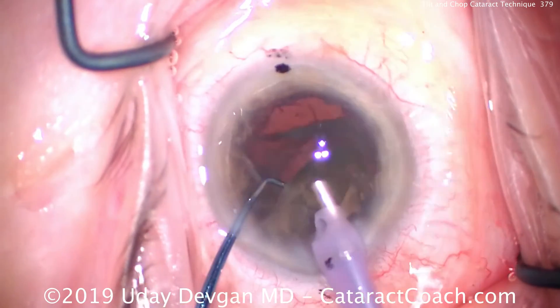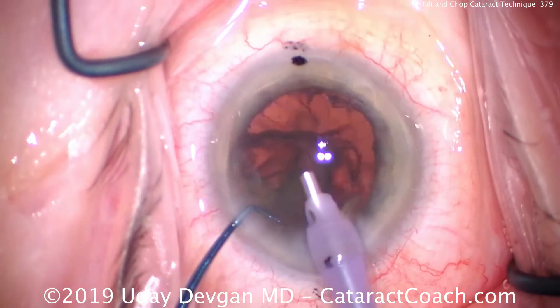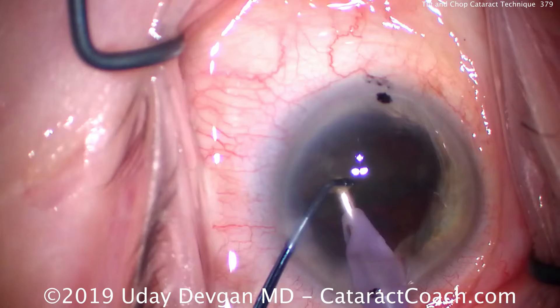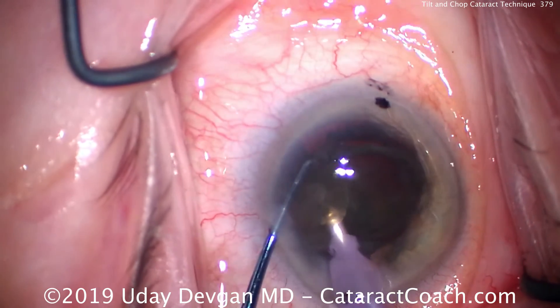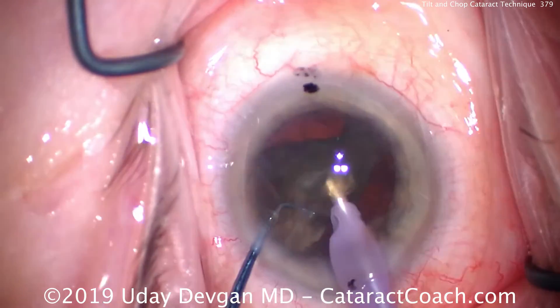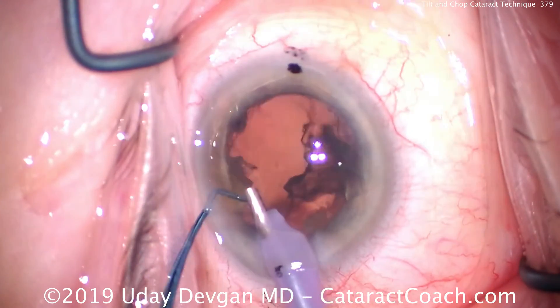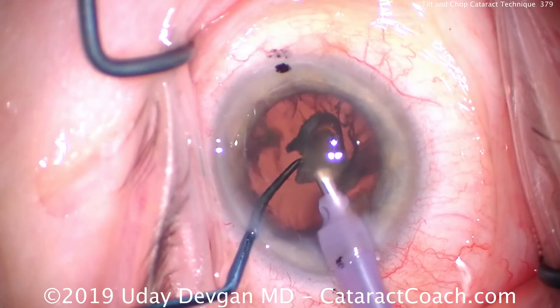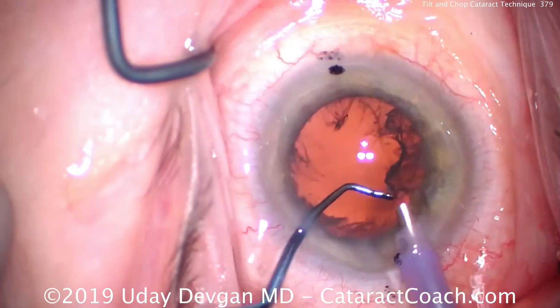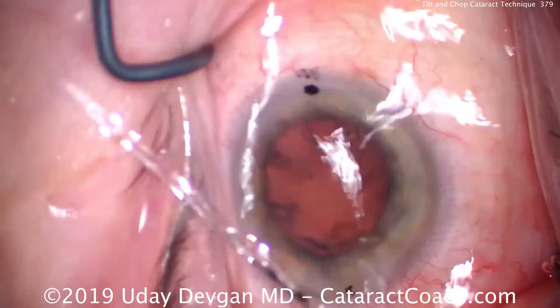Remember: phaco probe on one side, chopper to the other. At this point the rest is relatively soft — we can use the phaco probe to just aspirate this out as the chopper pushes the piece forwards. Another little baby chop here at the end, and this goes relatively smoothly. As the last piece of the nucleus comes towards the tip, we'll put the chopper in the safe position just to prevent any contact with the posterior capsule in case there's surge. And that looks great — it came out very quickly.